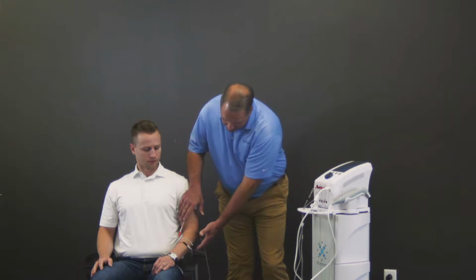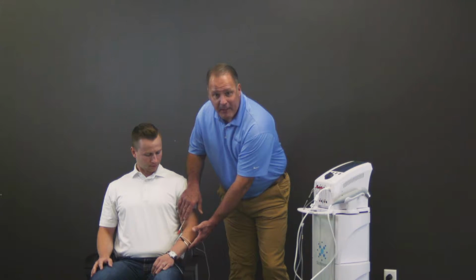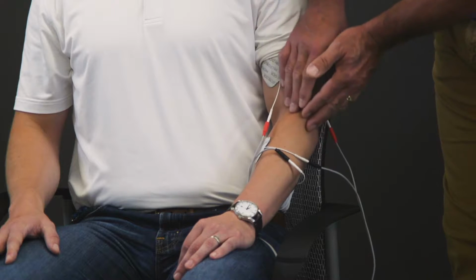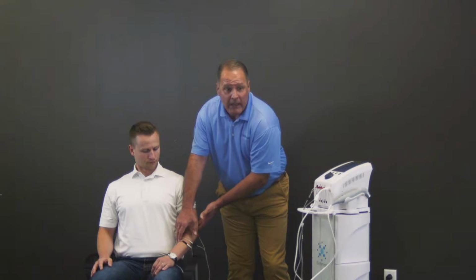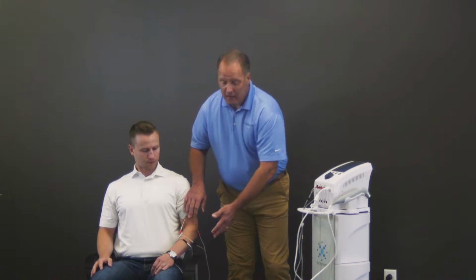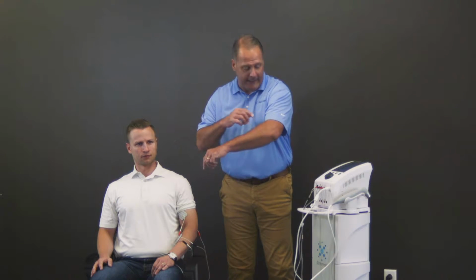So if I have it set at 40%, it's going to change the output to channel 1 by 40% more, come back to balanced, and then go to channel 2, add 40%, and keep varying that back and forth. It allows you to have that intersection in a much broader area, for someone who has more global pain versus just my elbow hurts here.